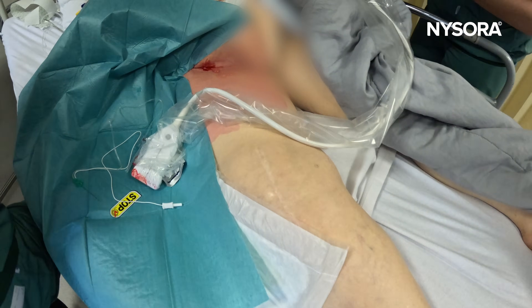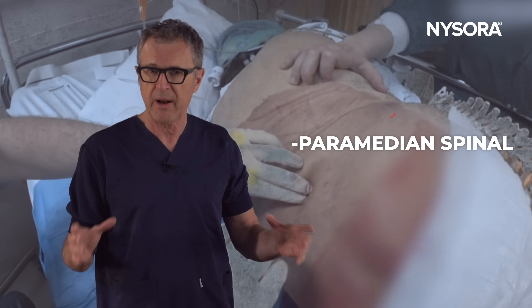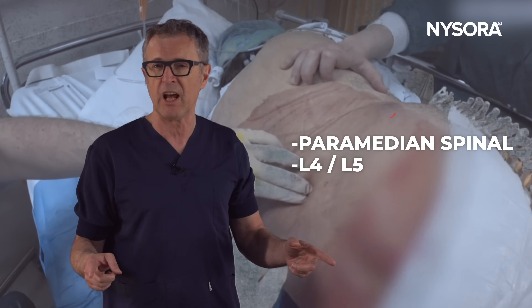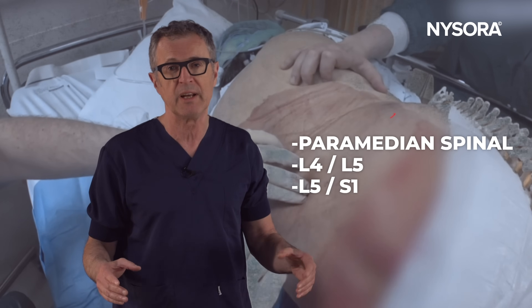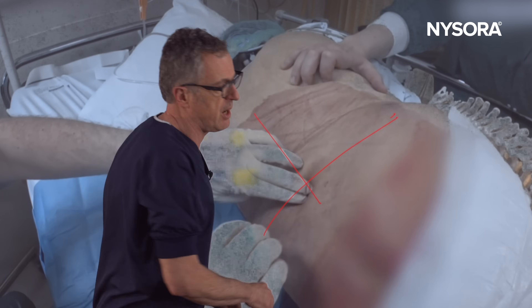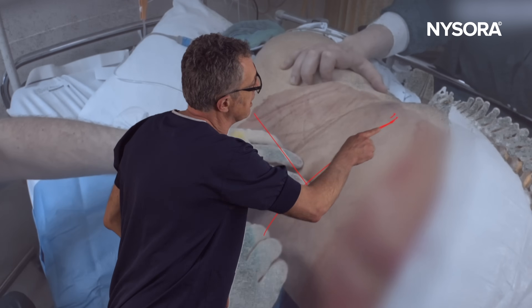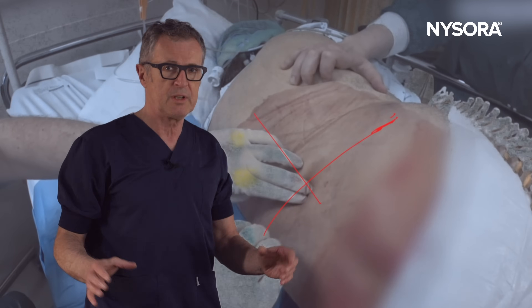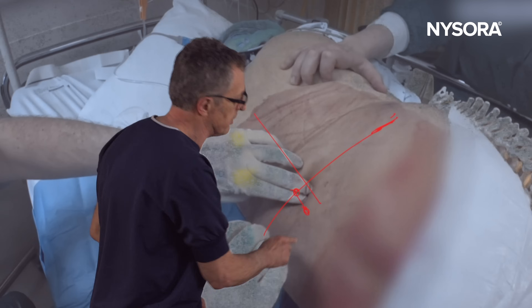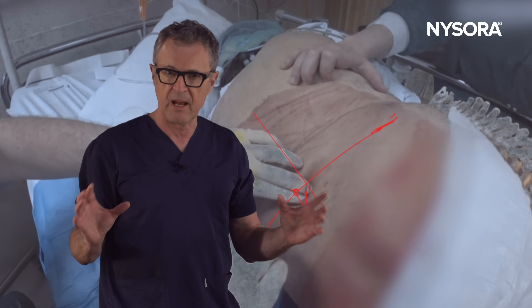Next comes the positioning for the spinal. In most of these patients we will perform a paramedial lateral approach to the spinal technique using L4-L5 or L5-S1 as the largest interspace. That's the midline — this will be about the line that passes through L4-L5 or L5-S1, just below the iliac crest. What you want to do is insert the needle two centimeters lateral to the midline and two centimeters caudad, with a slight needle orientation towards the midline and cephalad.